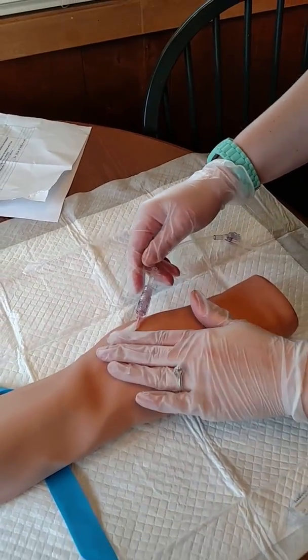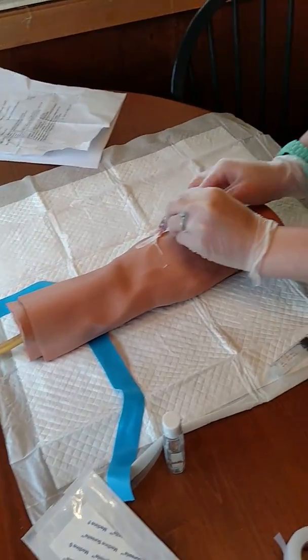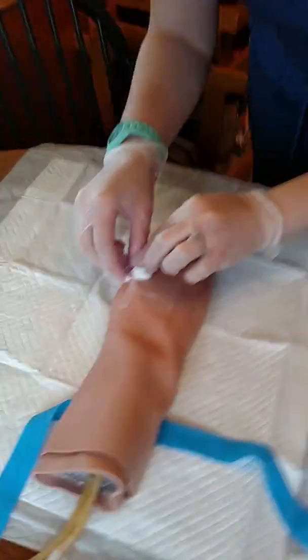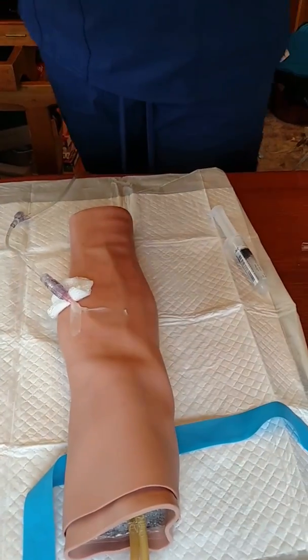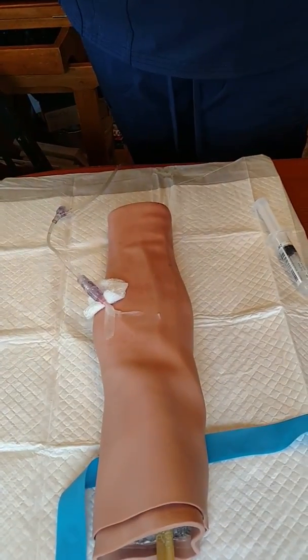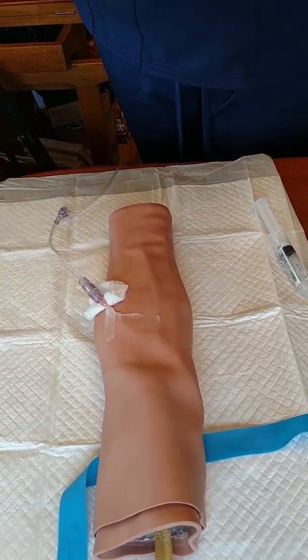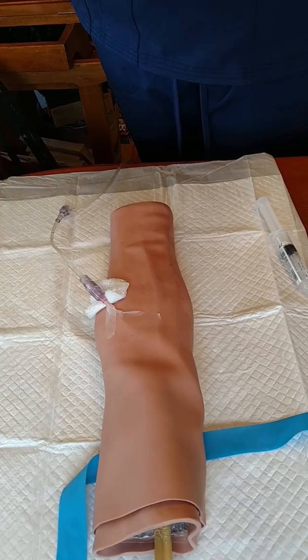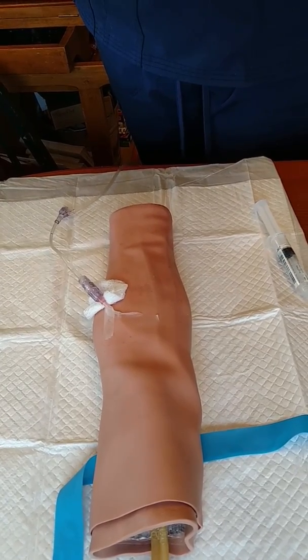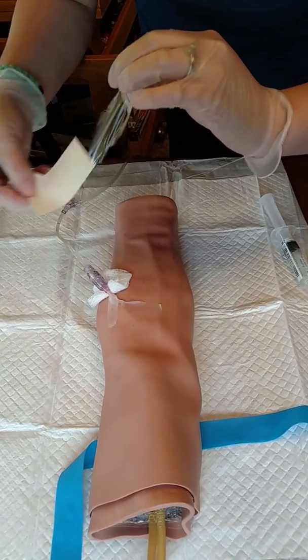Okay, so we've got our IV all hooked up. Now I'm going to get it supported here.